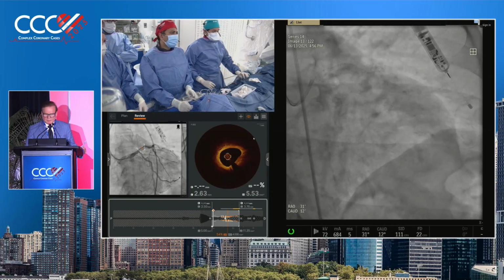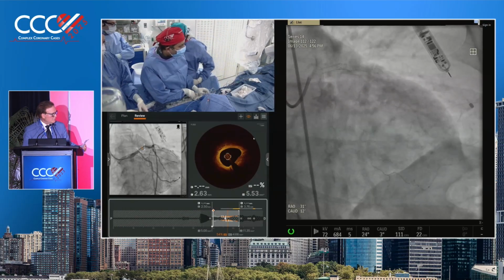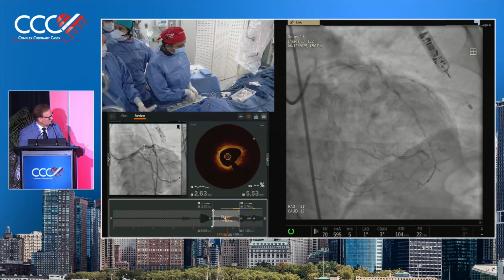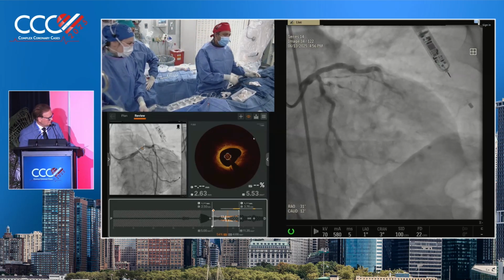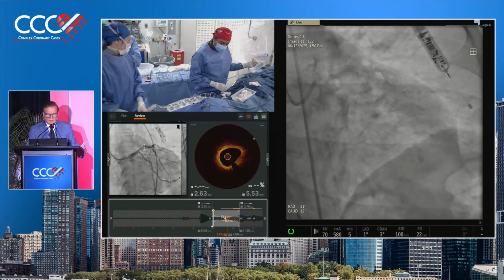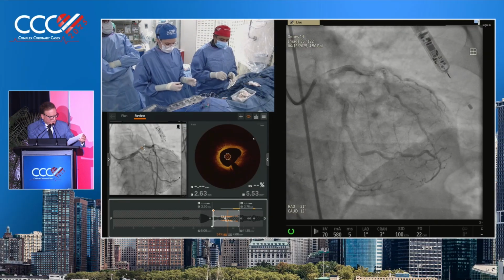Okay, we are done here. And now we'll go to the next room. Isn't it a little unusual from a morphologic standpoint that a 90-year-old who has calcification throughout their whole vessel has nothing superficial on angiography? Say that again? Isn't it a little unusual that a 90-year-old who has calcification throughout their whole vessel, angiography does not have anything that's superficial? I'm not so sure this is related to the process. This is a very good observation from Dr. Sala. Okay, are we moving on with the next case?